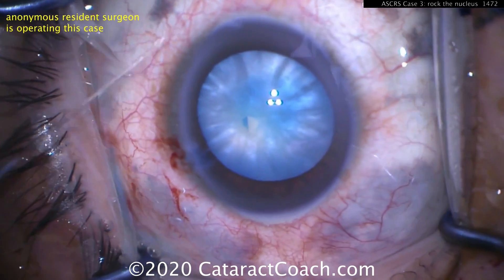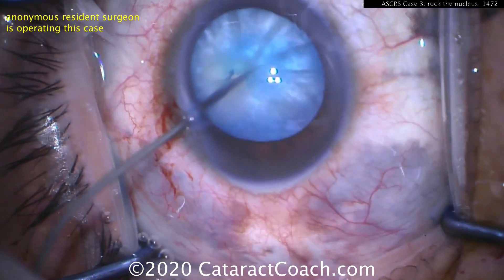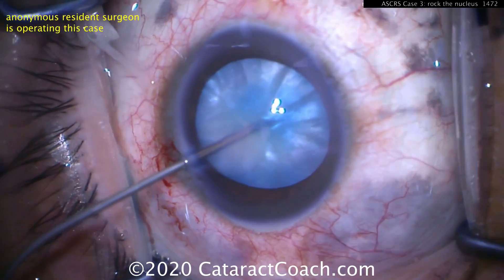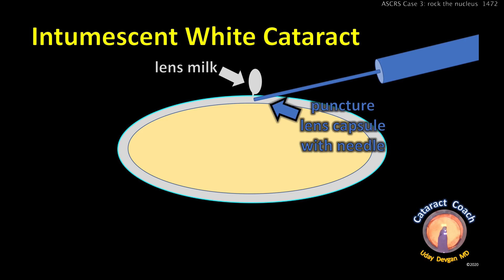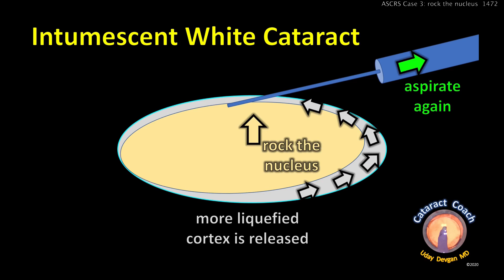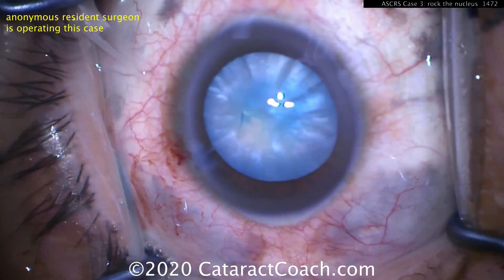We can inject that here on the cornea, then go in again and really rock this thing. Going in again with the needle — we'll release more fluid by rocking it around. Look at the milk that comes into the anterior chamber; you can aspirate it again. A liquefied lens cortex surrounds the entire nucleus. We go in with the needle decompression and puncture it — yes, we get out some of that lens milk. But then the nucleus moves up and there's more liquefied cortex trapped behind. So we have to rock that nucleus back and forth in order to release all of it. Now the capsular bag is completely depressurized and you can finish the case very easily.